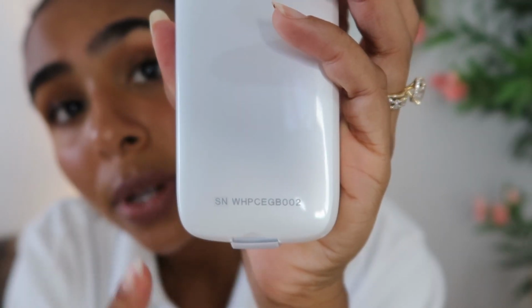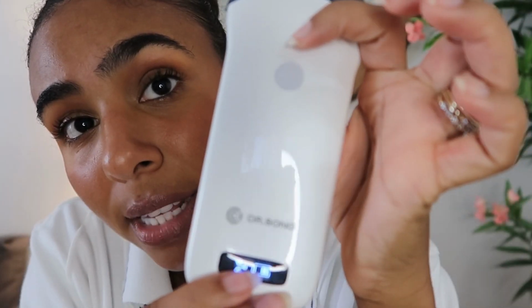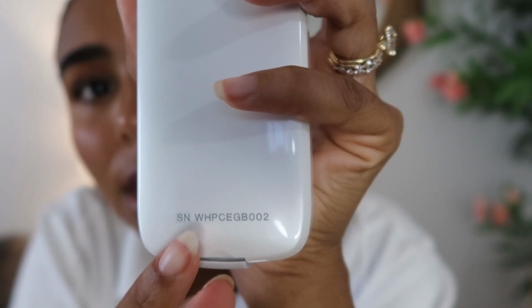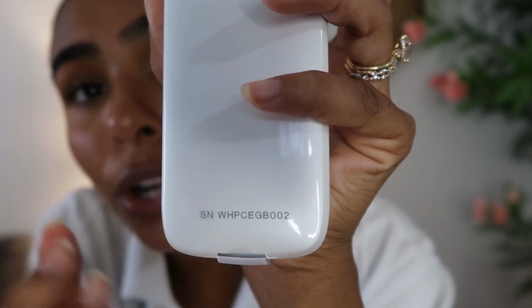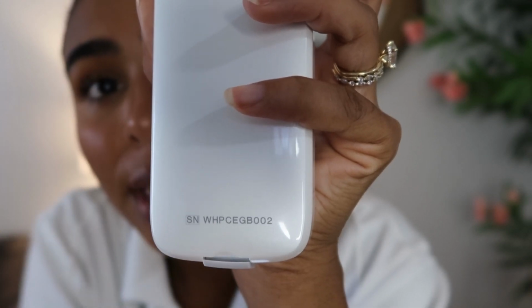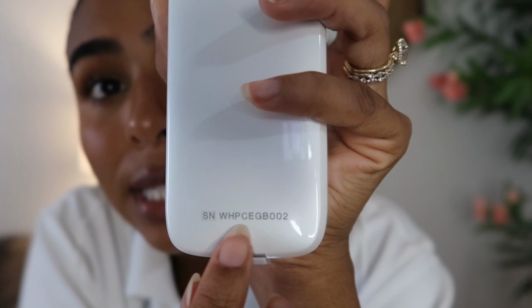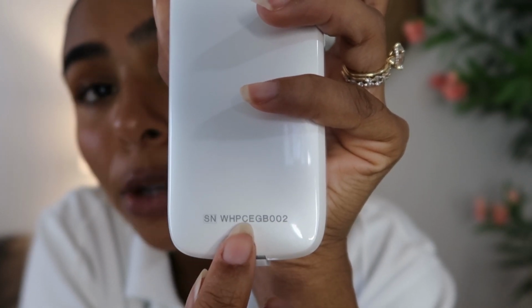So now that I've turned this probe on, you can see here that it's blinking, and this is what lets us know that it is ready for our wireless connection to whatever device we're using. Next thing you're going to do is look at the bottom of your probe on the back. So this is the front face here. Turn it around. You're going to use these numbers down here to identify your internet, and that's what you're going to go looking for in your Wi-Fi settings, and this is basically the router that you're going to be connecting to. When you see the internet that matches this, it also is going to be used as your password.